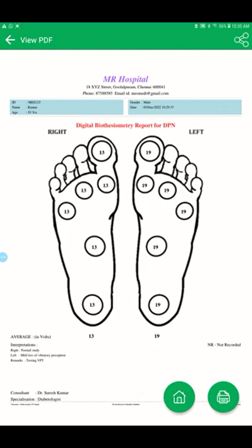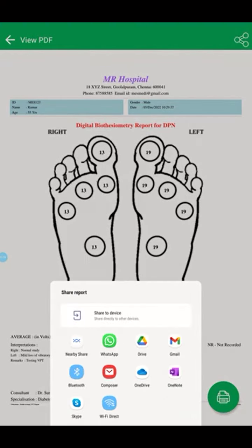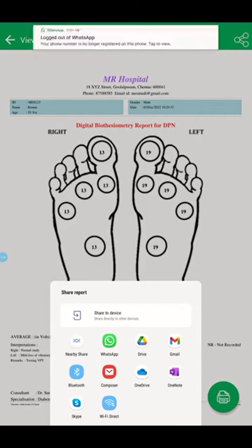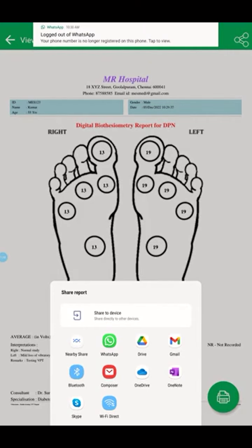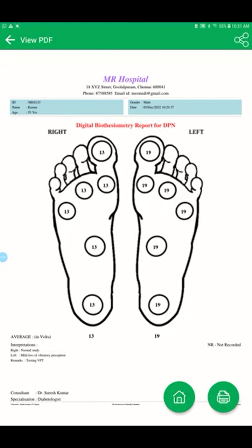Okay, otherwise on the top right corner you can see the sharing button. Once you select it, you can share it by WhatsApp, by email, or any other messengers you have. So now I have completed, and I want to do the next patient.